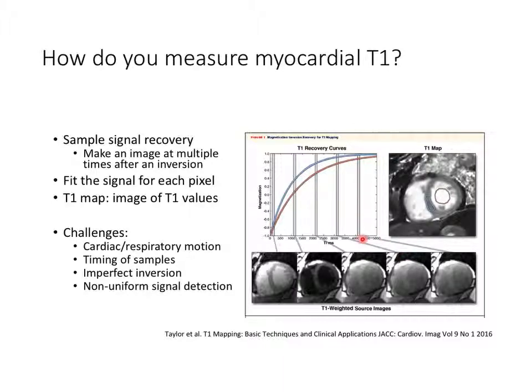And then these images take a really long time because you do a 180-degree pulse and then you wait a considerable time, many seconds, in order to acquire the data. And so there are long delays in there. To get all of these images, you're going to have to do each one on a separate breath hold, more than likely. And just to acquire that whole series is going to take you many minutes, sort of 10 minutes, something like that, if you do it like this.